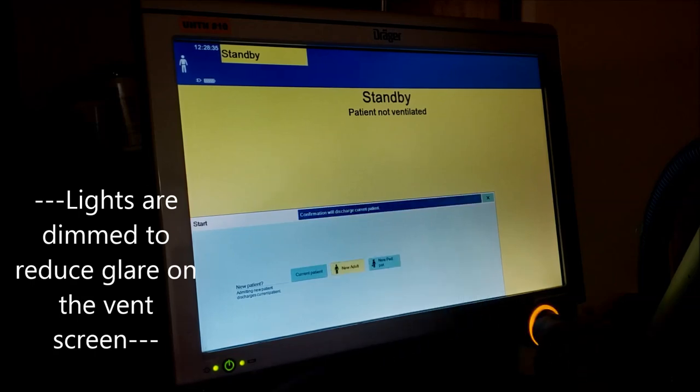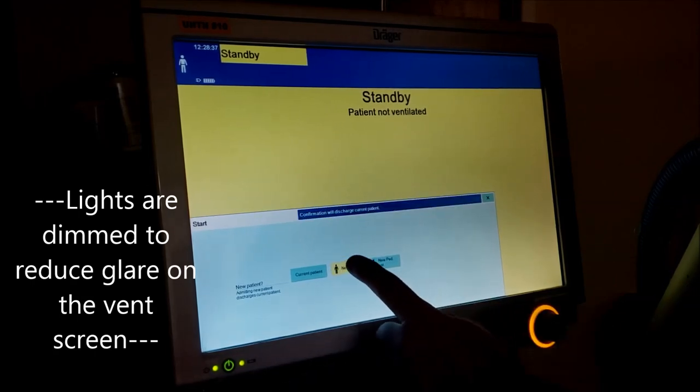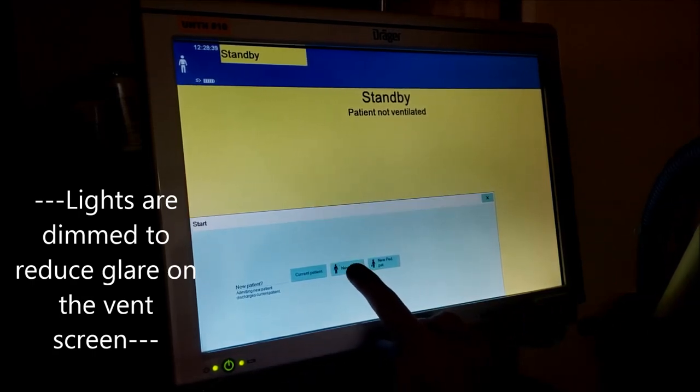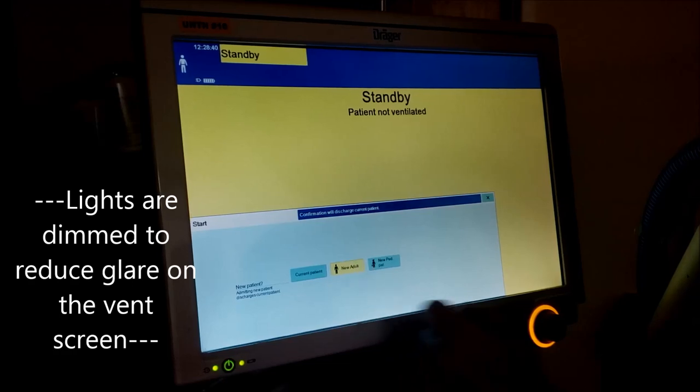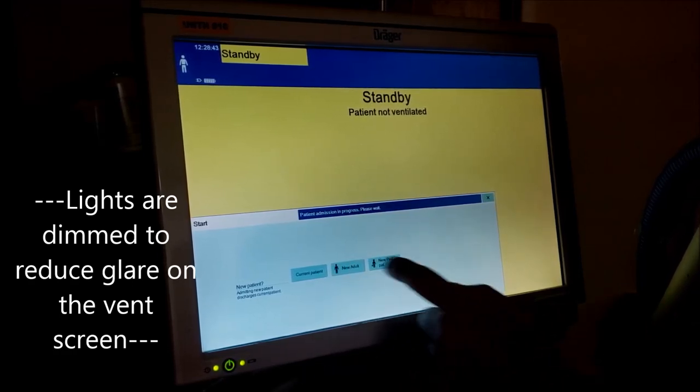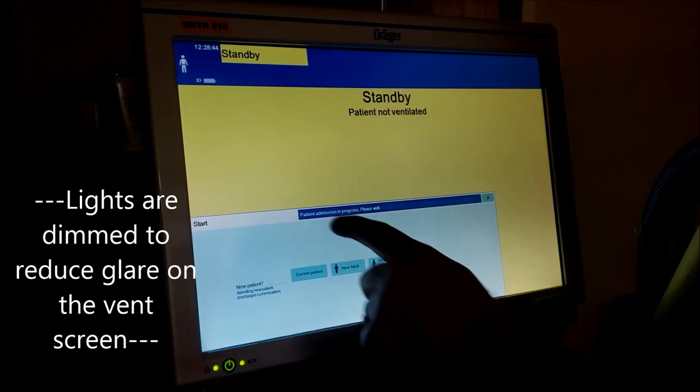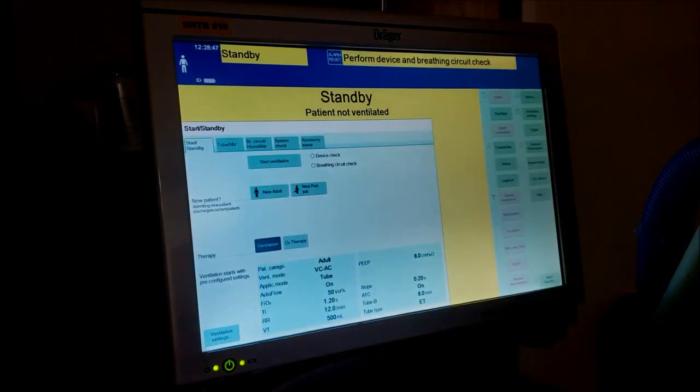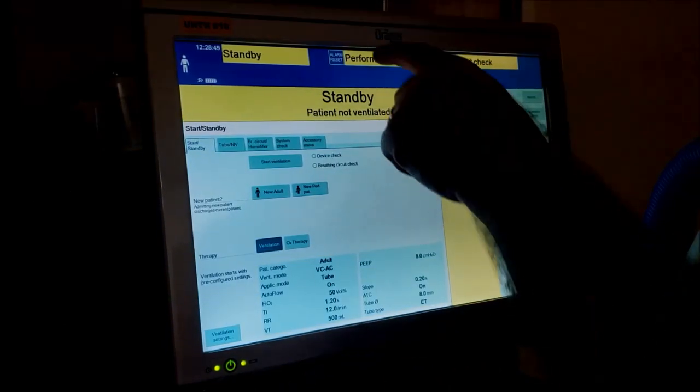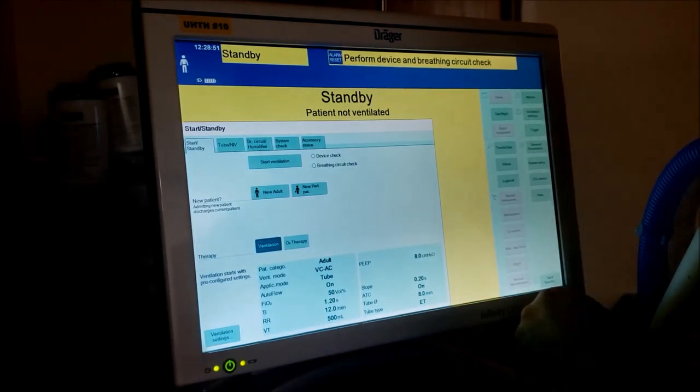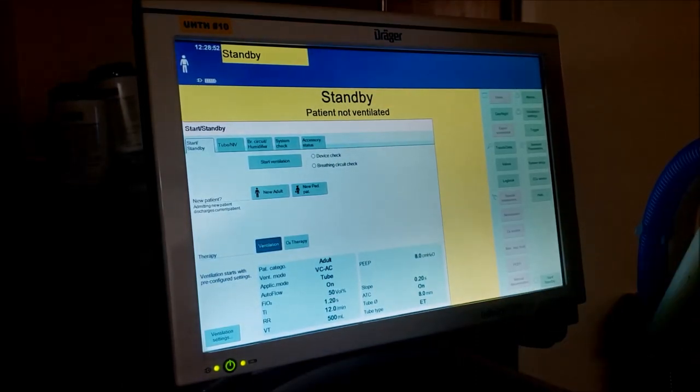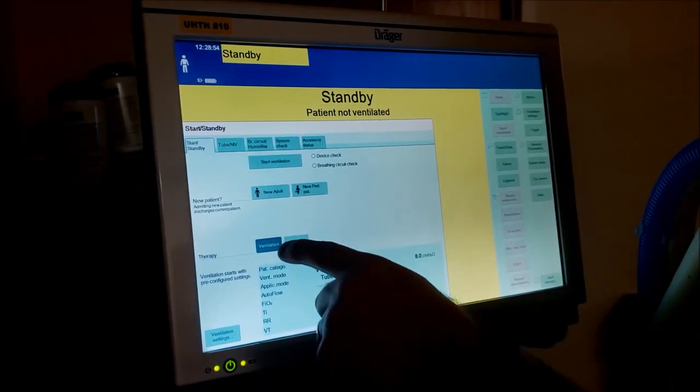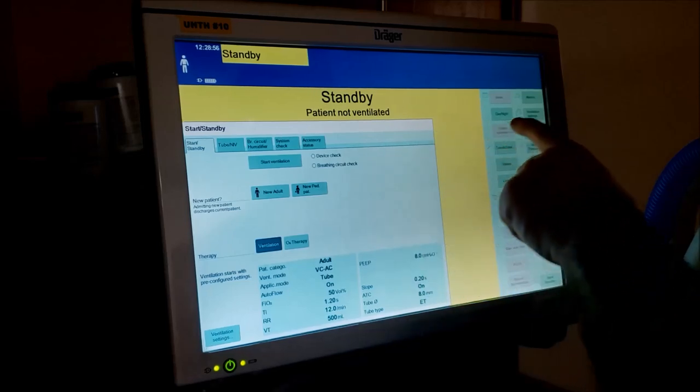Anytime you touch a button here, you're gonna see this light up down here. That means you have to activate it by hitting enter. Right now it's admitting the patient. At the top it says perform check - that's already been performed. We're gonna get that out of the way and then go to our initial settings.